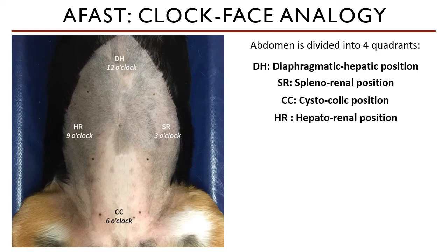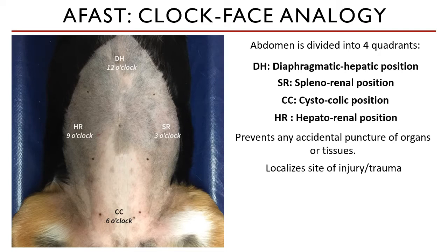These positions are assigned as numbers on the clock, starting from the diaphragmatic hepatic position at 12 o'clock, going clockwise. This system prevents any accidental puncture of organs and tissues inside the abdominal cavity. It also localizes the site of injury or trauma.